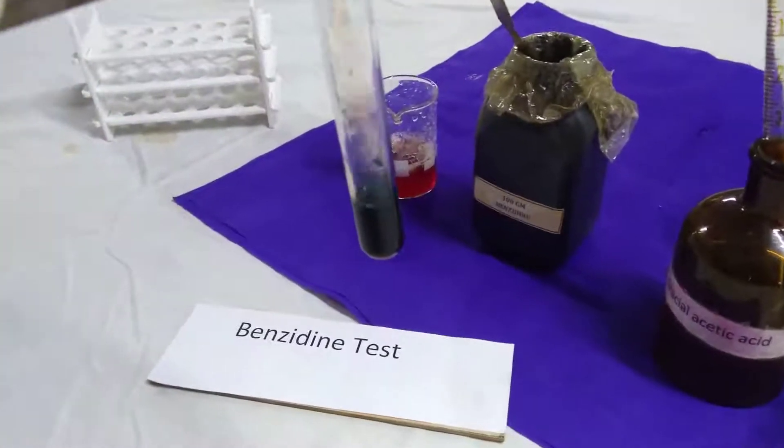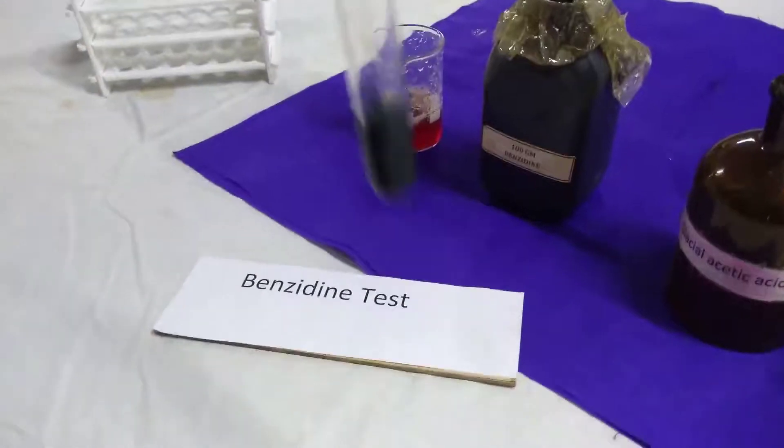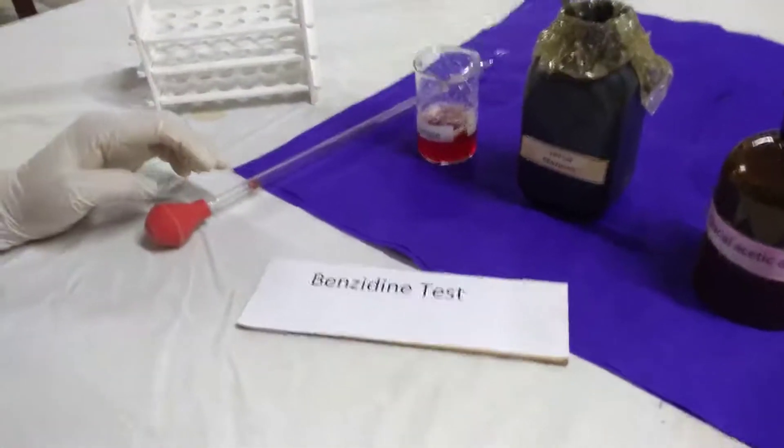Blue or green color develops which turns into brownish black after a few minutes. This indicates the presence of blood in urine.